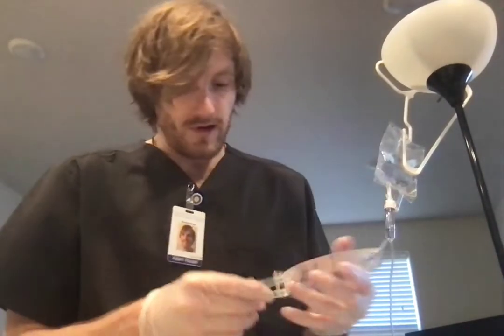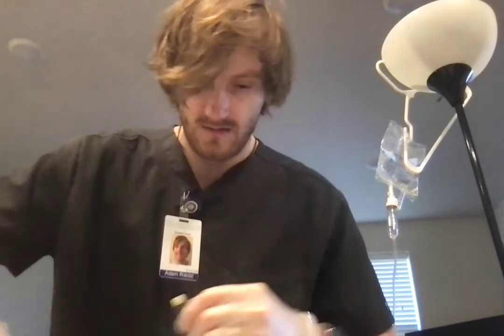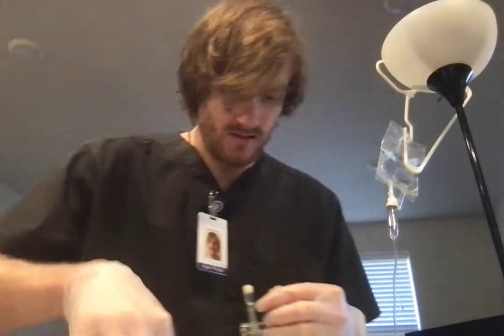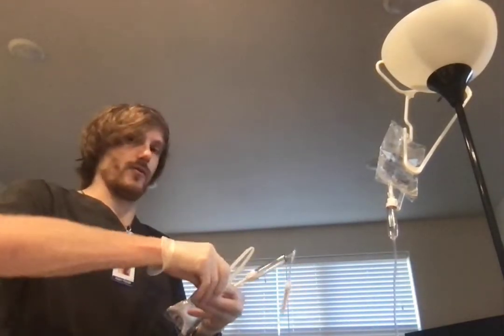And then we're going to administer this 100 milliliters within 15 minutes, and that's going to get us 16 drops every 10 seconds. Pretty darn fast. We're going to spike this with our secondary tubing. And the same thing as before, I don't want to push this into my patient's vein while I'm figuring out the drip factor.